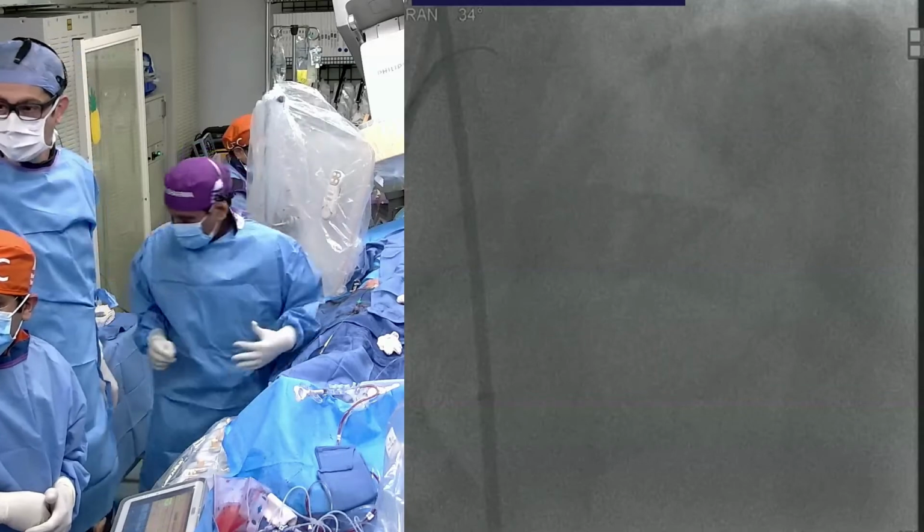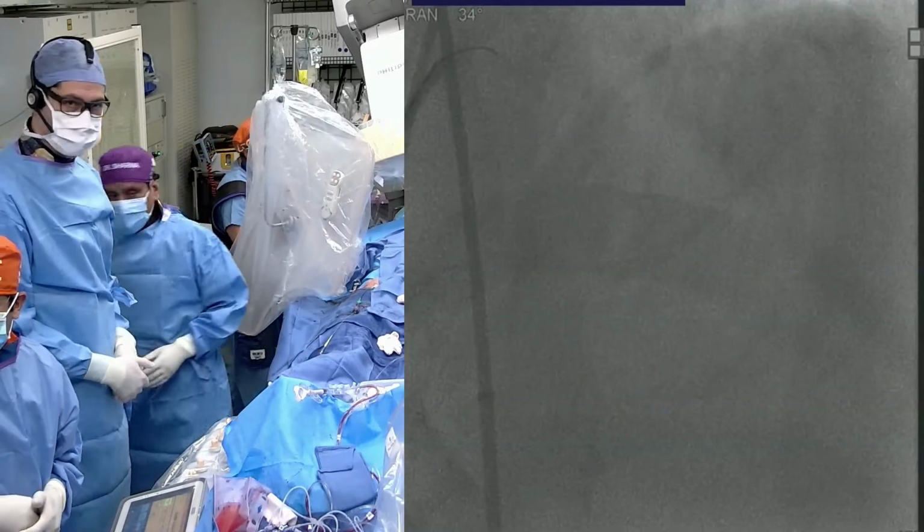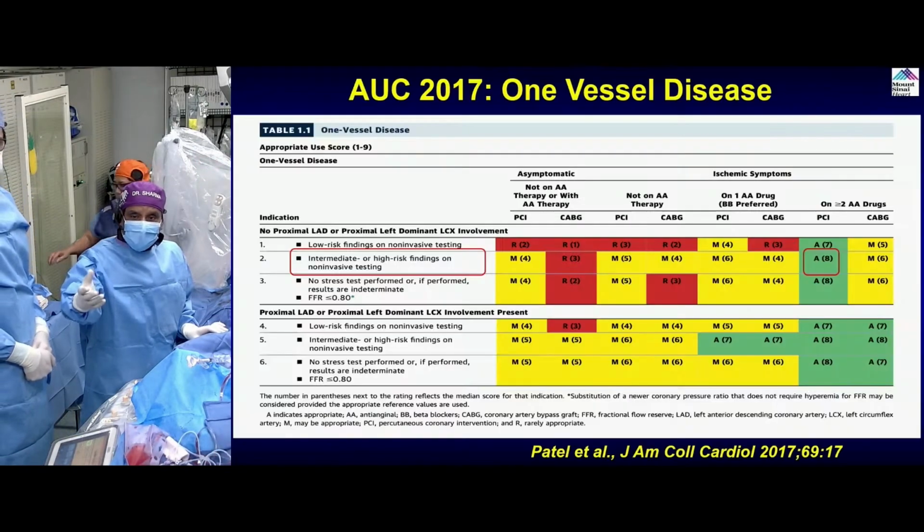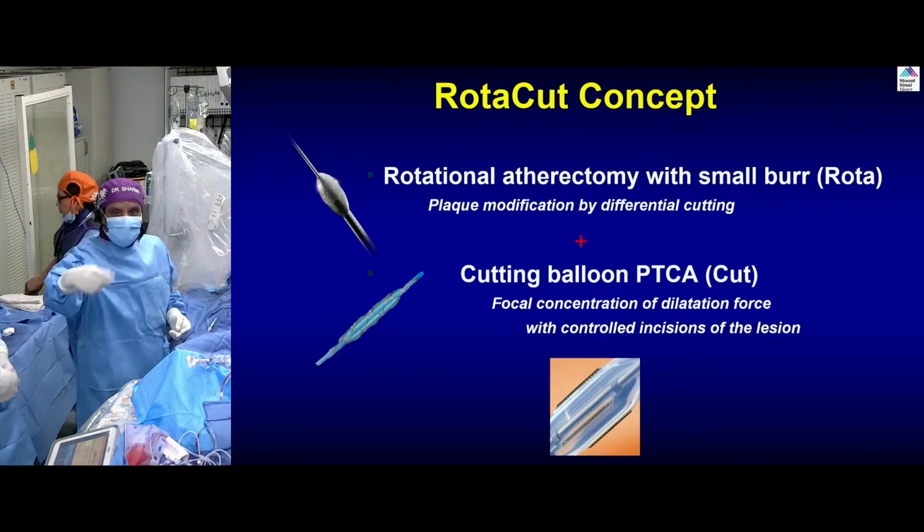This is our trial. Where is the slide advancer clicker? Can we buy the advancer clicker? Yeah, move it, then move, good.